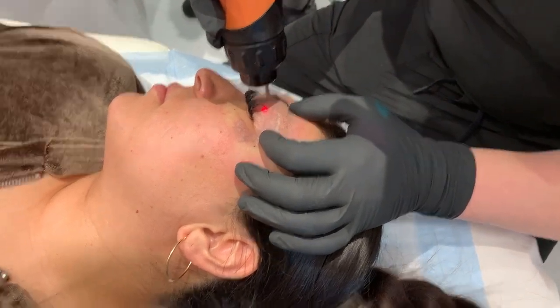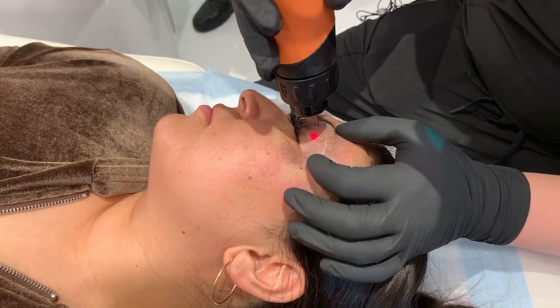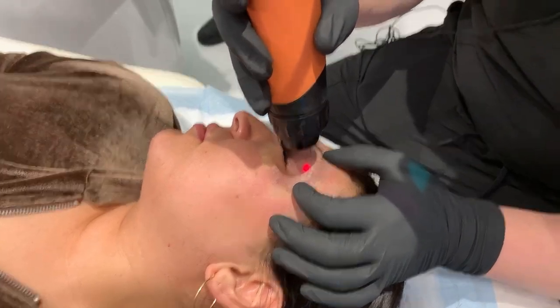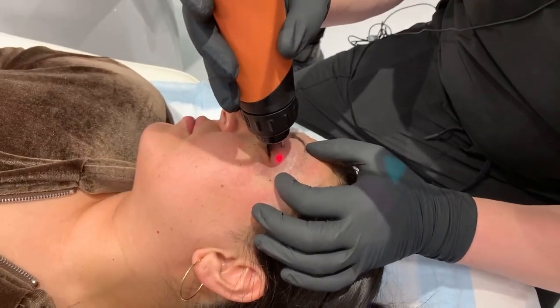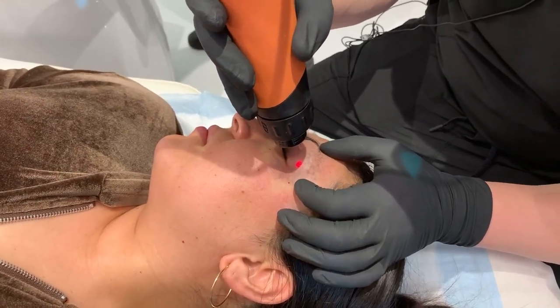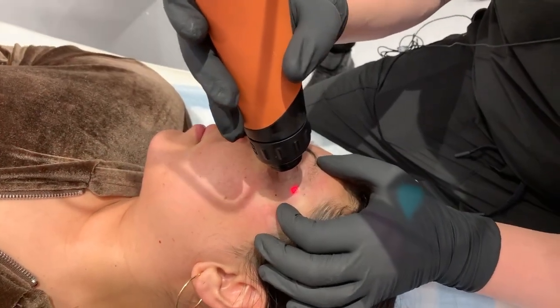And those gases will dissipate in about roughly 20 to 30 minutes, but a lot faster if we use the patch. They want to know, is this for brown pigment only? What about red pigment? This is only brown. We can switch the laser to a red, to use for red, just FYI.